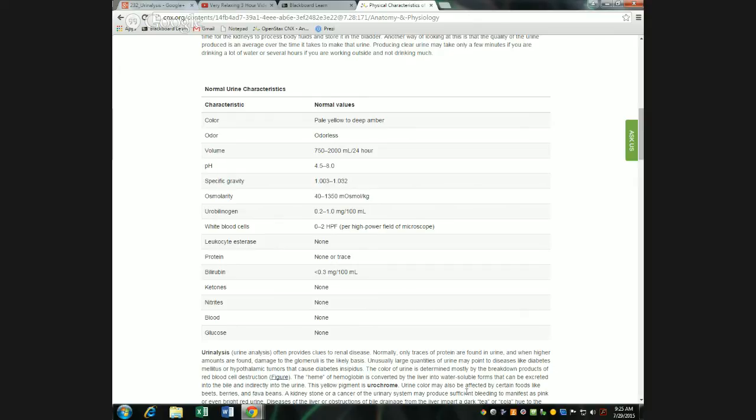If you feel that you need to put on gloves, feel free, but really it's not necessary if you're only handling your own sample.